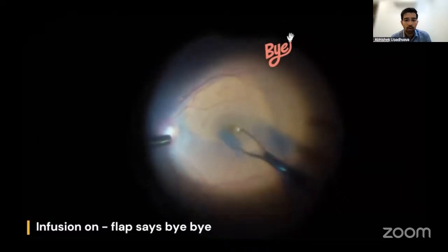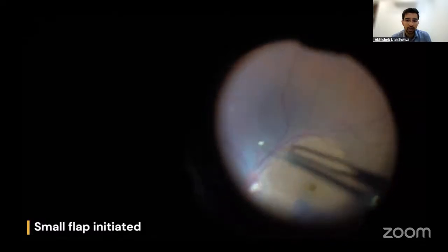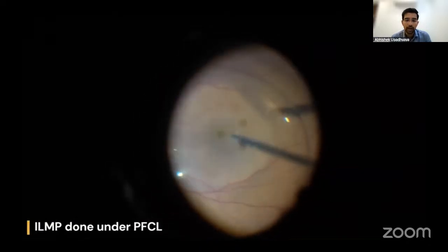So in the end, I thought let me try something else. I still had superior ILM. So I initiated the peel normally and then put PFCL so as to stabilize the flap. Under PFCL, I made a very long free flap and then positioned it over the macula.